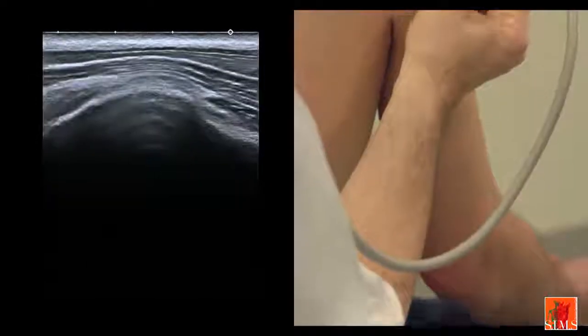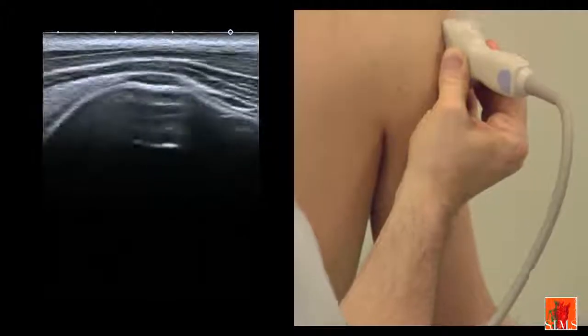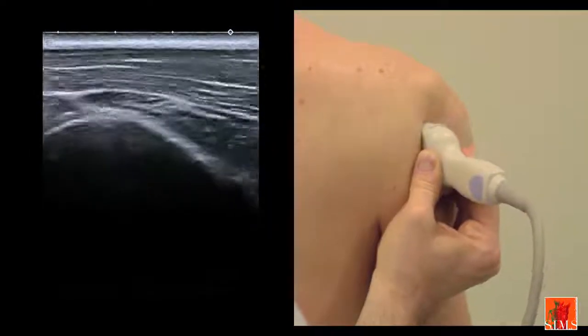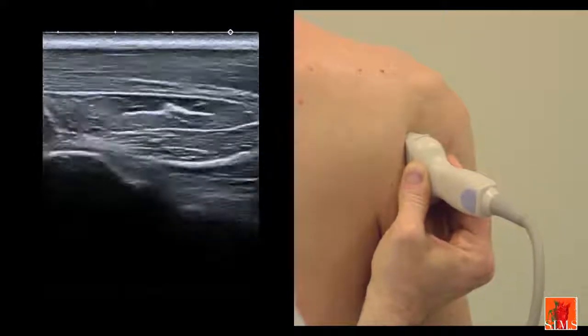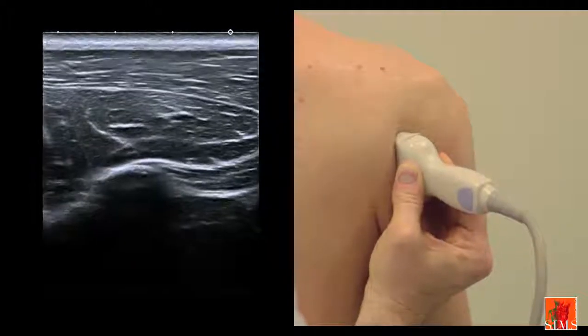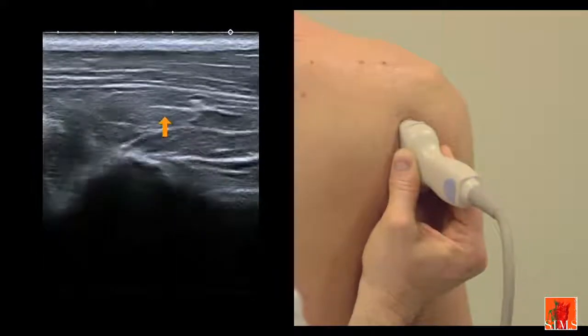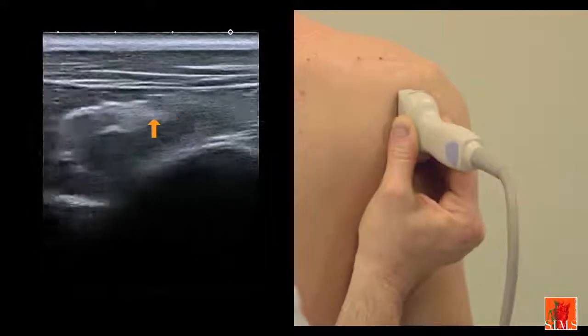We continue the exploration of the teres minor by moving the transducer, starting from our sagittal image of reference. In this favourable case, you can see that the subject shows a perfectly identifiable intramuscular aponeurosis, which can be easily differentiated from the overlying infraspinatus.